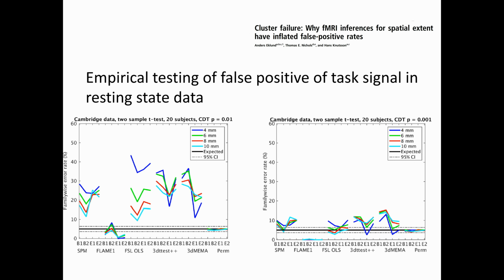So one easy way of helping out your data a lot is setting that p-value a lot higher. So setting it to p .001, you can clean up that data, and that's what's displayed there on the right. It's also hard to see, but right down here, you can see a line which actually overlaps with the expected range. That's permutations, and we'll get back to that in a little bit, how permutations can actually be your friend.